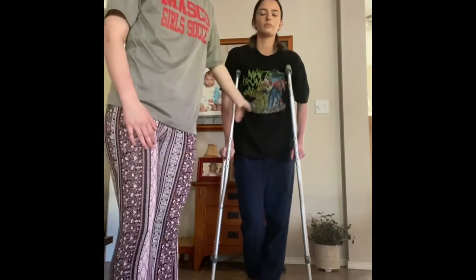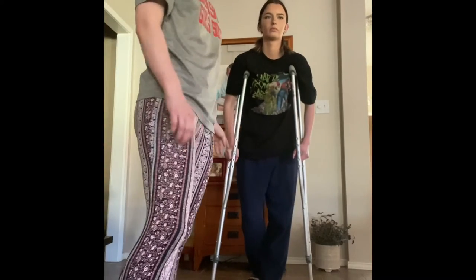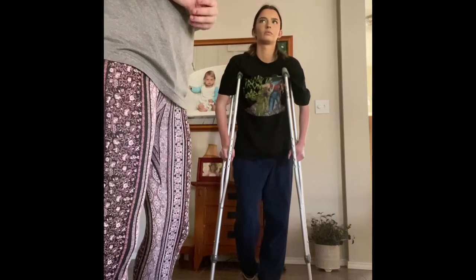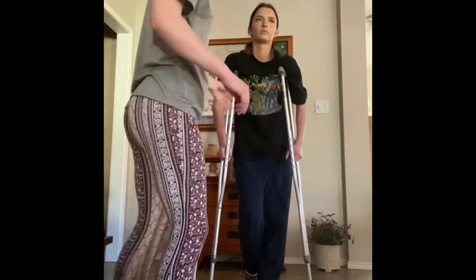I am Sage Erk and this is Campbell Erk as my patient. My walking technique is the two-point walking technique, which means two points on the ground — whether it be a crutch or a foot. My patient is going to move on the injured side, so if her right foot is injured, the left crutch is going to move. She's going to demonstrate that right now.